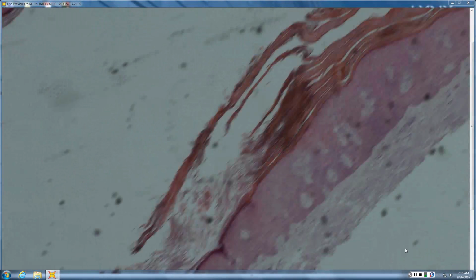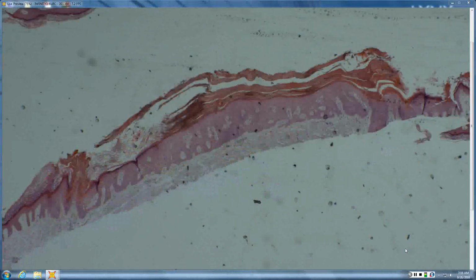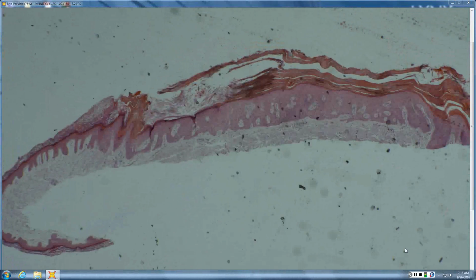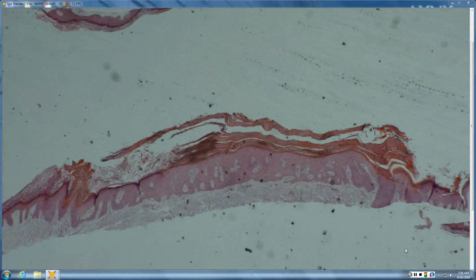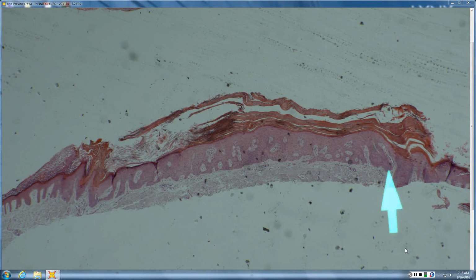Okay, so 13. This is porokeratosis. This one, of course, everyone loves to get on boards or tests of things, because as long as you don't miss the cornoid lamella, you say porokeratosis and you move on. The only reason why it's really in this box is because in between the cornoid lamella, the little choo-choo train smokestack here, in between there, you can have anything.